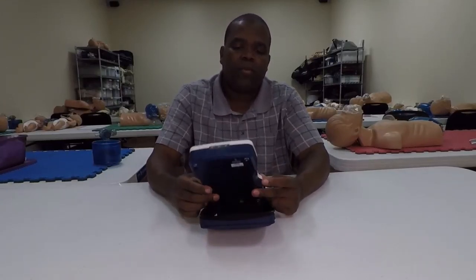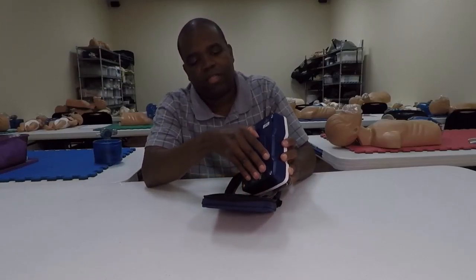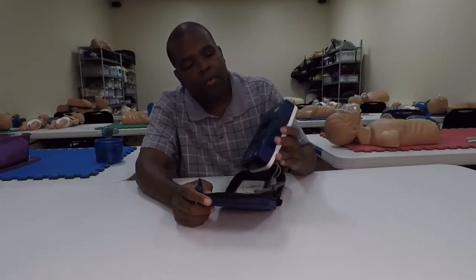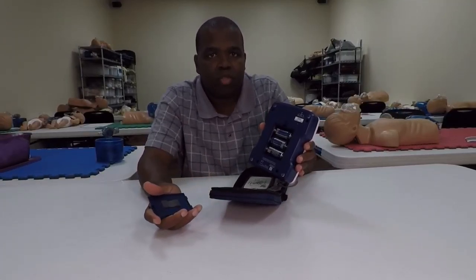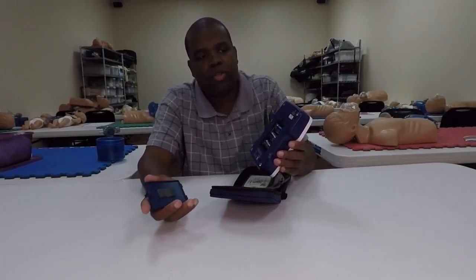As always, it's a digital device so we've got a battery situation to look at. We're looking at three C batteries, which shouldn't be too bad — again, depending on how much usage you actually have.